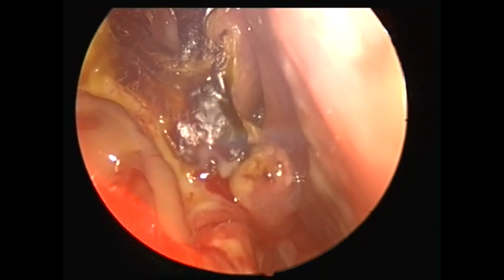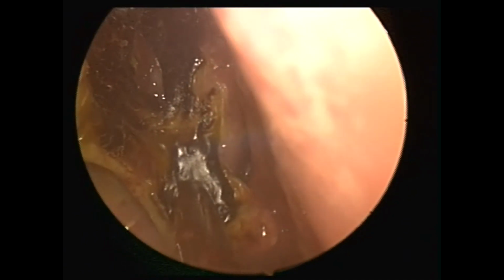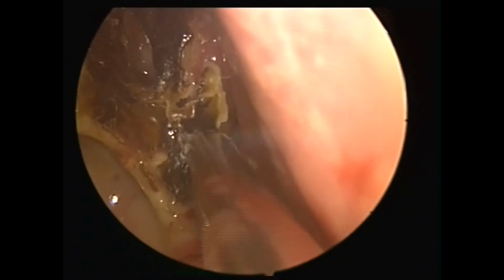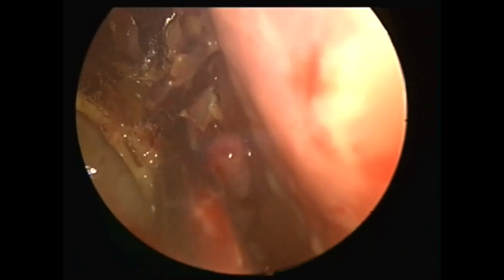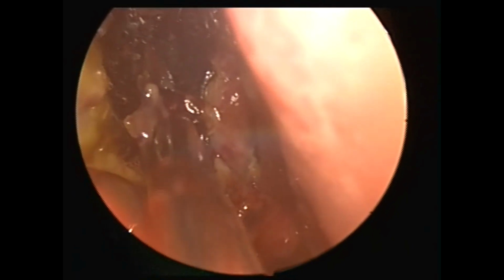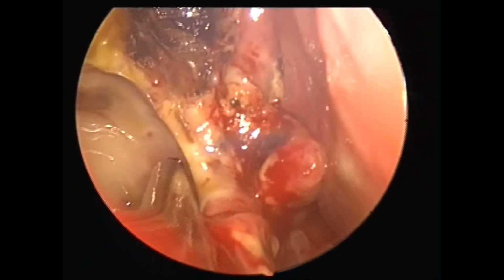You can see all that pus collection inside because of the entrapment caused by all that scab. You can see that's the area of the posterior end of the middle turbinate. We had done the resection of the middle turbinate as well to have a good post-op space for nasal washes, the steroid nasal washes.